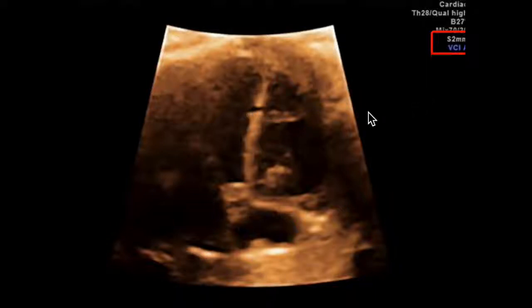And lo and behold, there's this black hole in the ventricular septum. Well, the addition of the contrast imaging gave you these really sharp borders to appreciate the VSD, instead of just looking at, maybe there's dropout there and I'm not sure what that is.